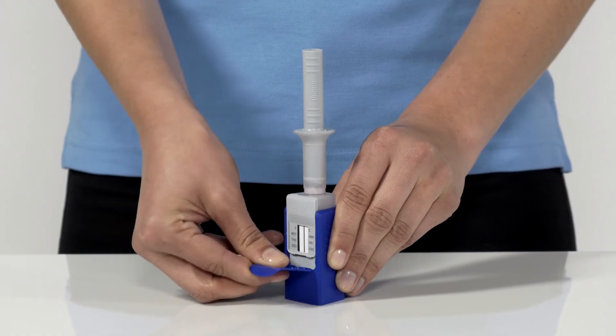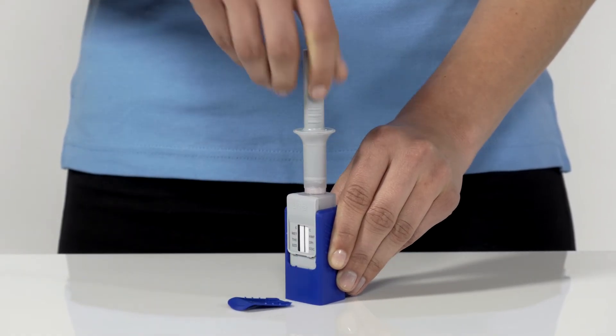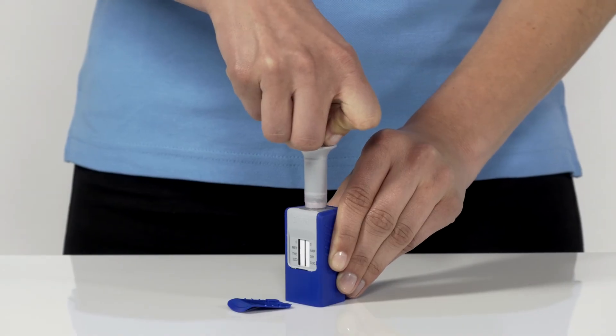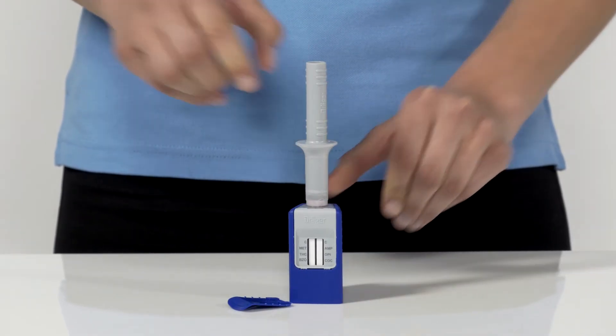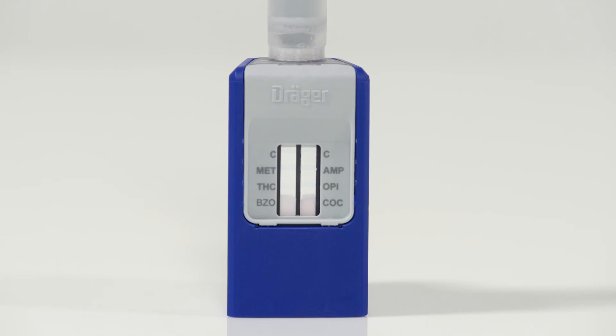After the wait time has passed, pull down the security tab to completely detach it. Then push the sampler straight down into the test kit up to the stop. The test has now begun. The control and test lines appear after around 2-3 minutes. You can then read off the results.